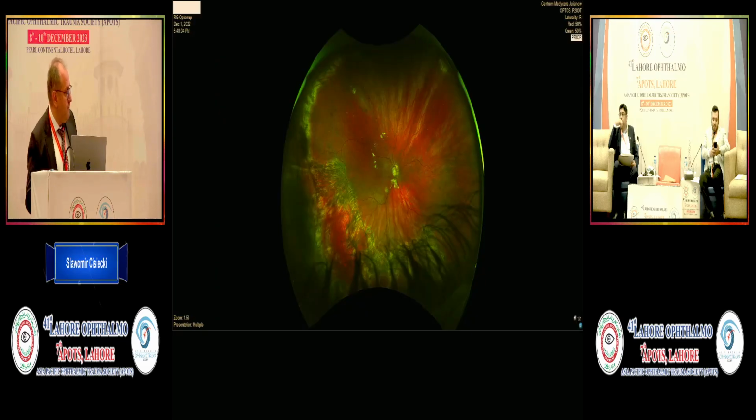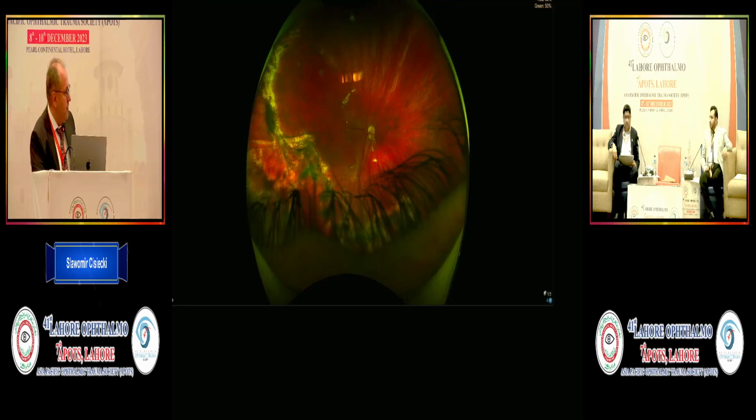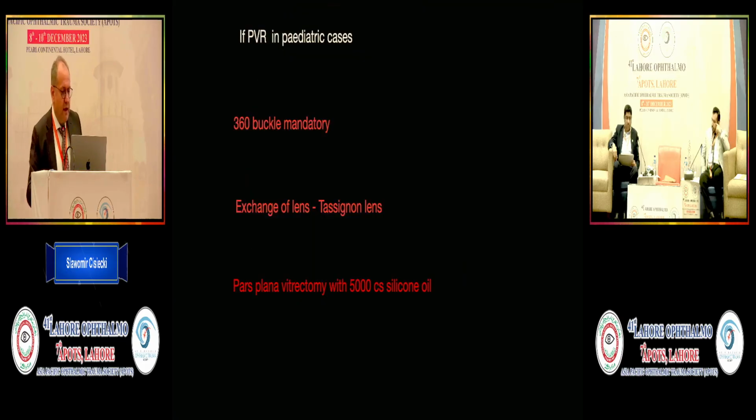And the problem with pediatric retinal detachment is much more serious than only the leakage of the wounds. This is a case of a 10-year-old girl after giant retinal tears. It looks very good under the silicone oil after 1 month, but in the second month of follow-up, you are able to see some PVR. It's coming up even more exaggerated at 3 months. So if we smell PVR coming up, we actually have 3 things to do.